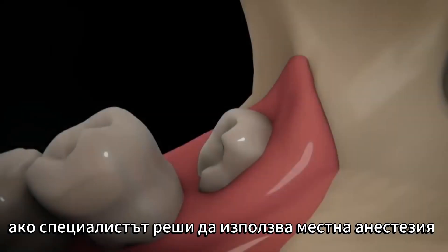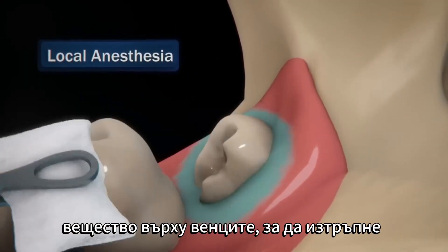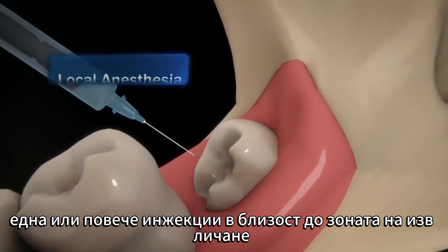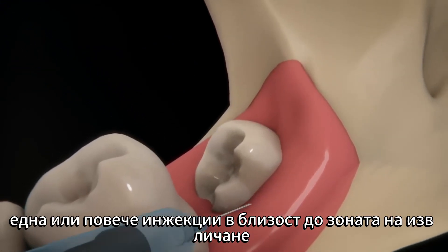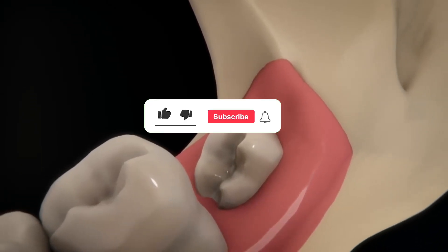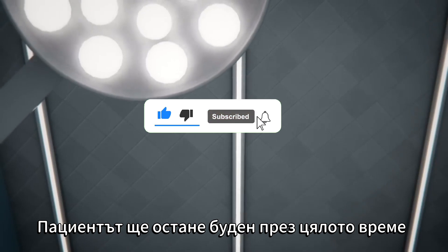If the specialist decides to use local anesthesia, they will first place a substance on the gums to numb them and then apply one or more injections near the extraction area so that the patient does not feel pain during the procedure. The patient will remain awake the entire time.